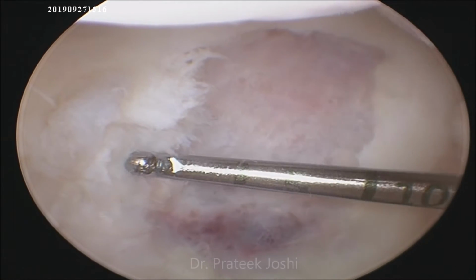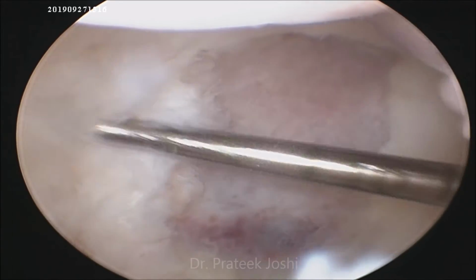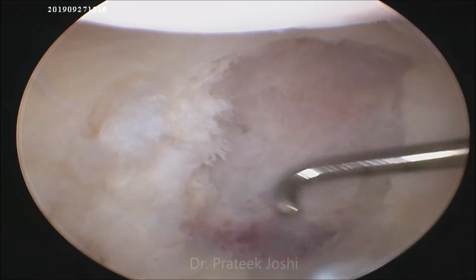So we have excised the unstable OCD fragment. As you can see, the dimension of the lesion is 10 mm by 20 mm.